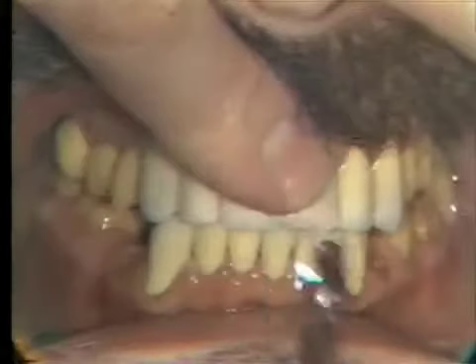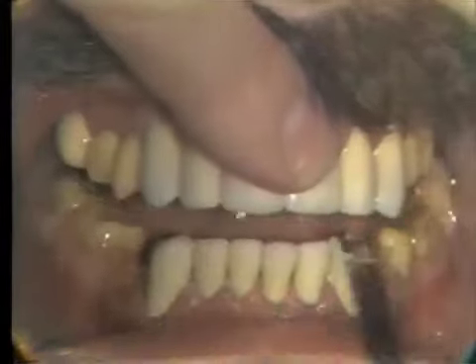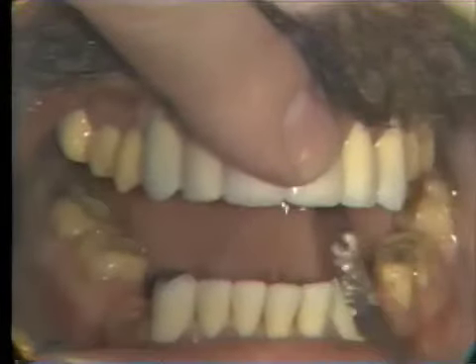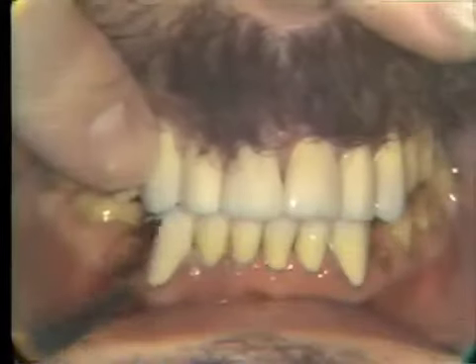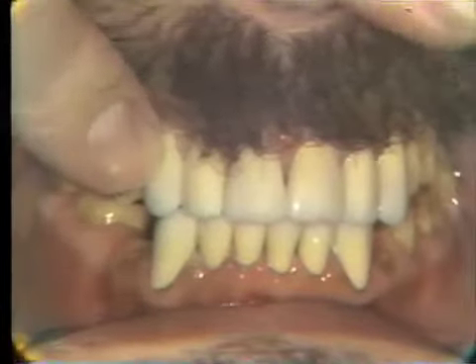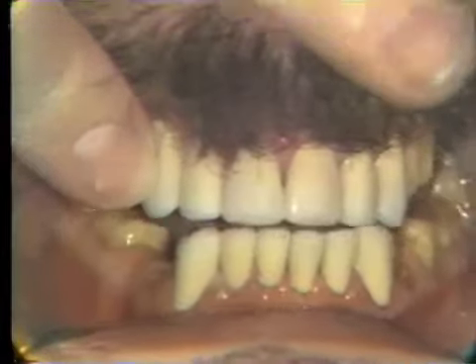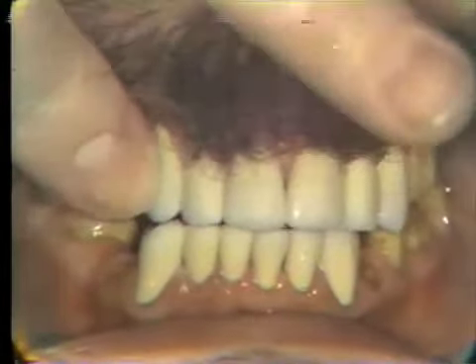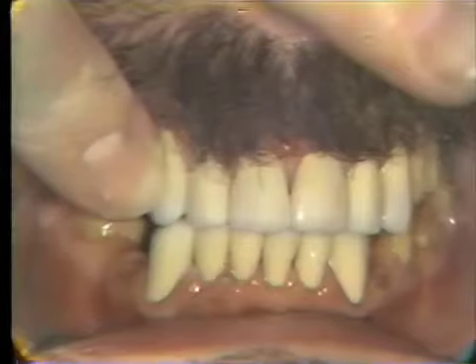Open, close on the back. Close. Open. Open, please. Close. Open. Close. Rub from side to side again, please. Now you can put your finger against the labial surface of the canine anterior. That's a nice, smooth movement. If you feel any bumping at all in that area, then you need to reduce it some more.